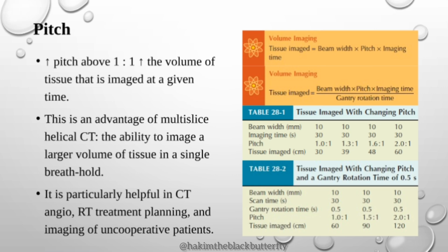Pitch that you can use, because it limits you within that pitch, it only gives you a pitch at which it can do the interpolation very well. But of course, as I said, interpolation is just an estimate.